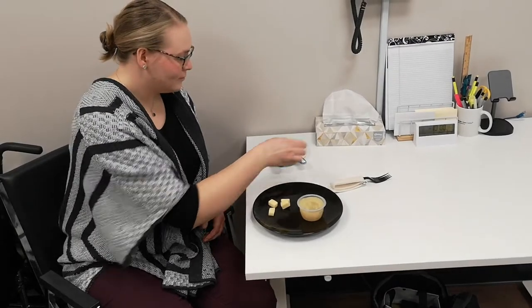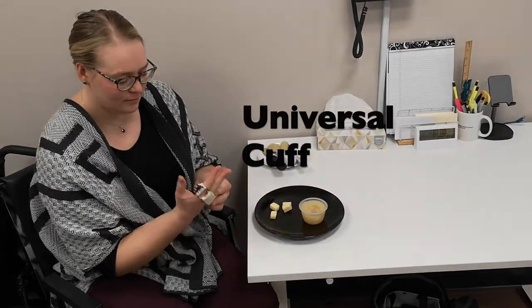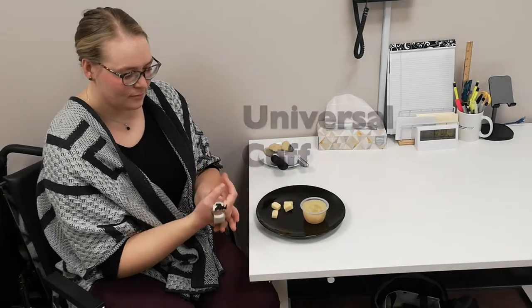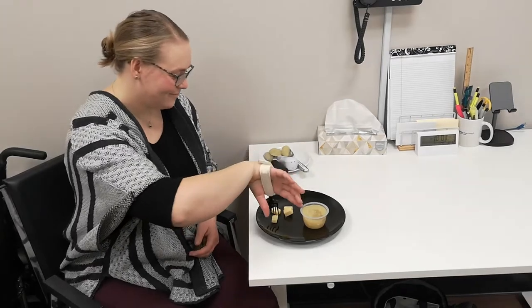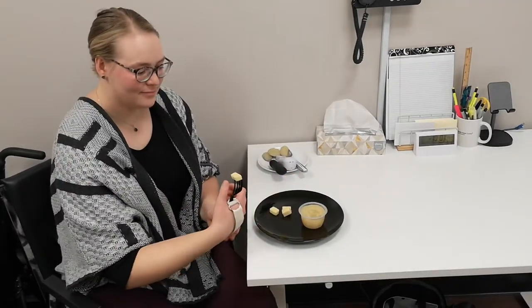The final option is a universal cuff. This device can be useful for those with limited grip and dexterity. It is called universal because it can be used with other items like a toothbrush or a razor.